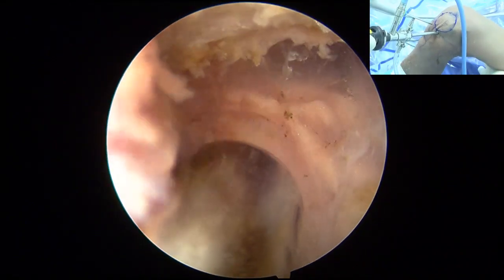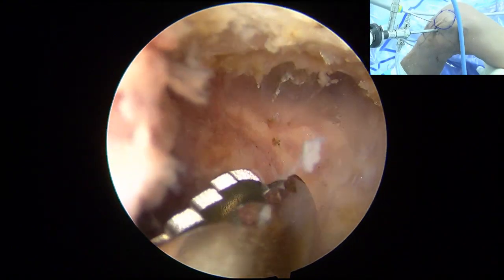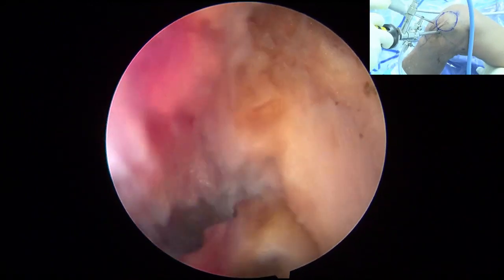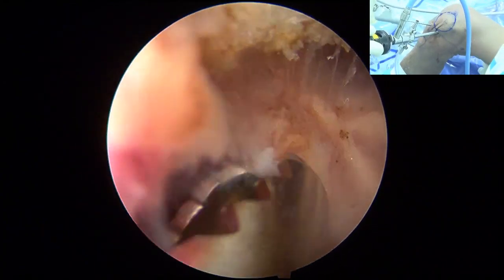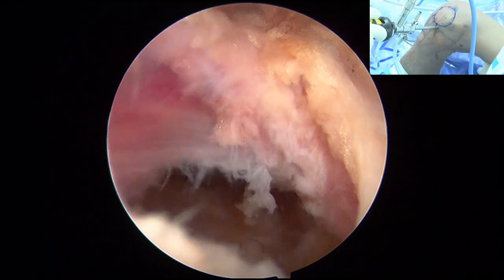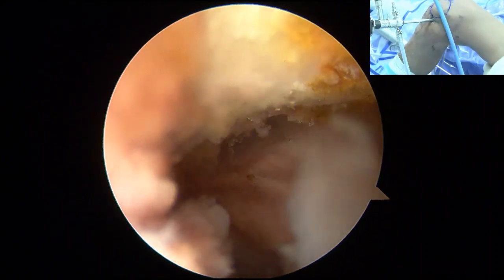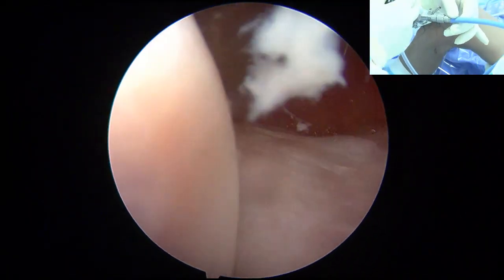已经形成一个穿孔了。So this is safe if you're not going beyond the roof, not beyond this. Okay? 所以就强调刚才清十二点方向的时候，不要清太深。You see the holes there? That's a hole to the posterior medial compartment. You see that? Here. 这个开口就是通向后内间室。Okay, just behind the PCL. 它就在 PCL 的后方。Now you see the holes there. That is the window. You follow this window. 就开通了。You follow this window. 就沿着这个通道入路。That is the window to the posterior medial compartment. 就是后内间室的通道。Okay. You follow this.